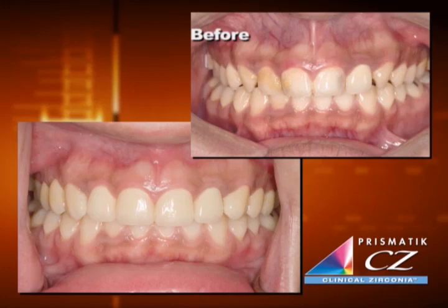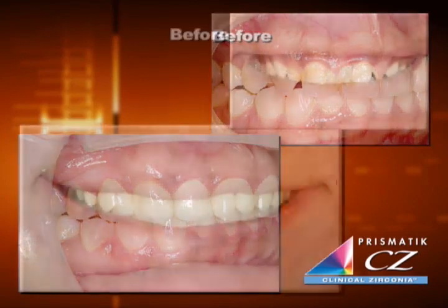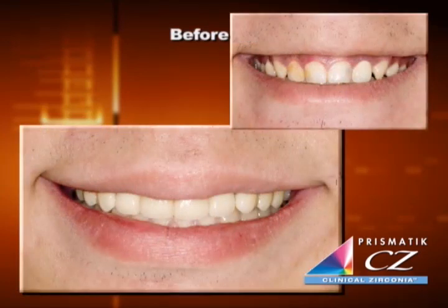And you can see when you look at the before picture and the after picture how we've closed up a lot of unwanted incisal embrasure spaces and really got an improvement in the entire maxillary arch aesthetically, and only had to prep 4 teeth. So again, the no-prep veneers are a great adjunct to doing needed restorative work in the anterior regions, especially in the smile zone on the maxillary teeth, as you see here. So we get some great results.